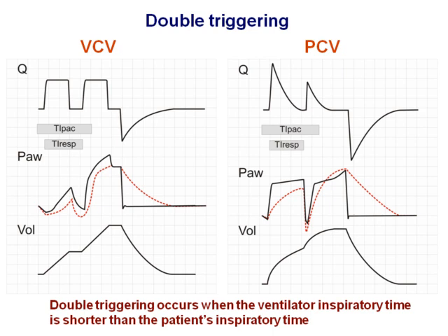In pressure control, it's a little bit different, because then the next breath in that case is limited by the mechanics of the respiratory system, and maybe the increase in tidal volume is not as high as in the preceding breath. What it looks like here, as you will see, is this pattern on the pressure waveform, and the flow is not symmetric.